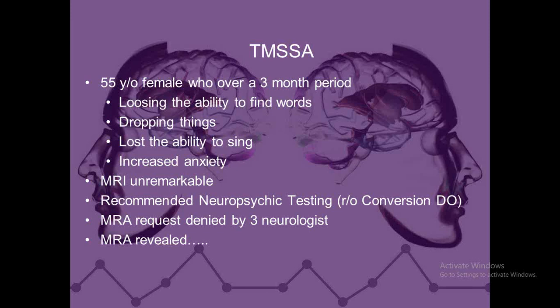Well, I've known this female for quite a while, and I wanted to see an MRA. Jay Gunkelman sent me a paper by Niedermeyer, a study done in 1989, that found that this activity was closely associated with cerebral vascular issues, mostly in women, mostly over 50. So it's like we've got to keep searching.